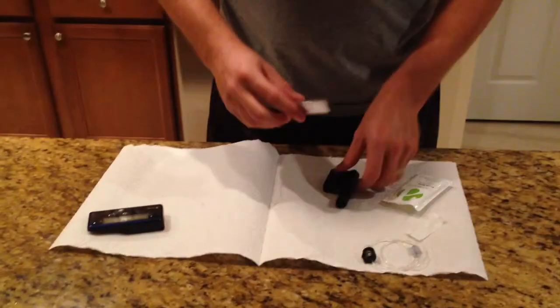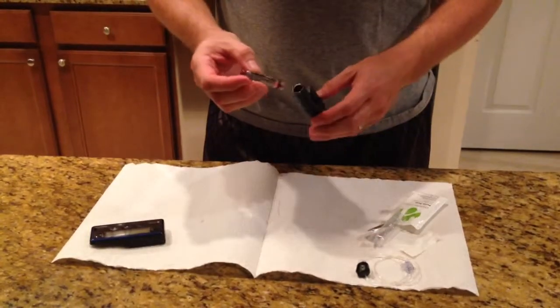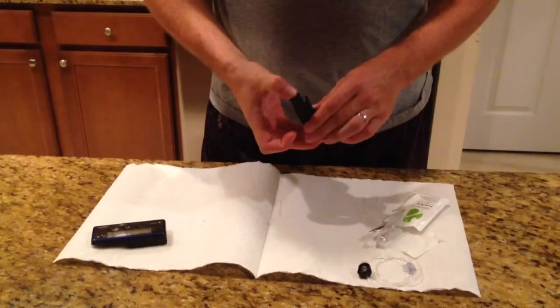Pull out the tab. Put the new cartridge in — 300 units of Humalog. Put it right in the top.